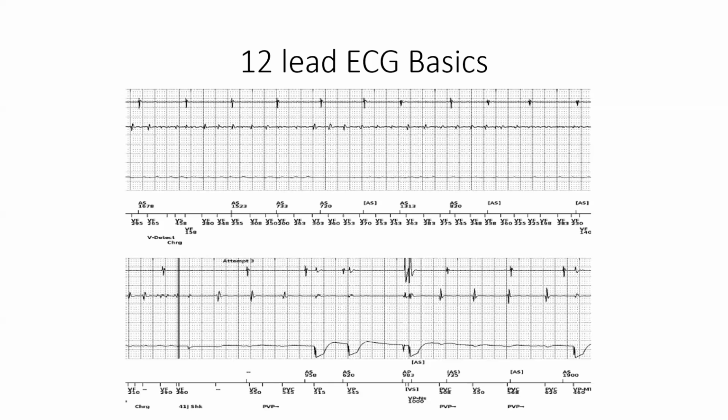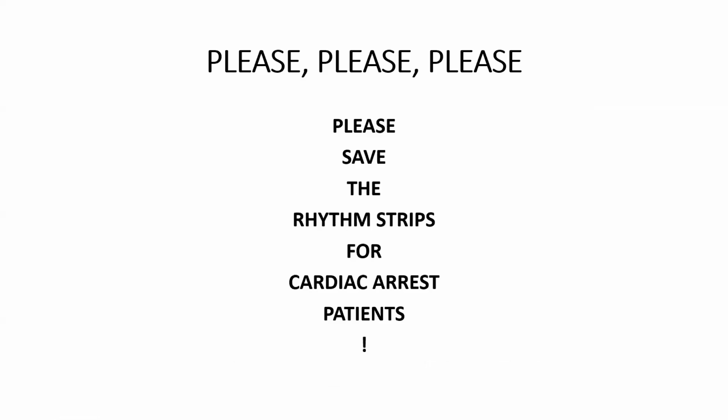I will wrap things up here and am happy to take any questions. The one thing that I do want to leave you with is that in the field, if you are caring for a patient, resuscitating a patient in a cardiac arrest, if there is any way to save the rhythm strips from the defibrillator, that's really helpful for cardiology and especially electrophysiology when we're trying to figure out what rhythm were they in and do they potentially need an ICD or not.